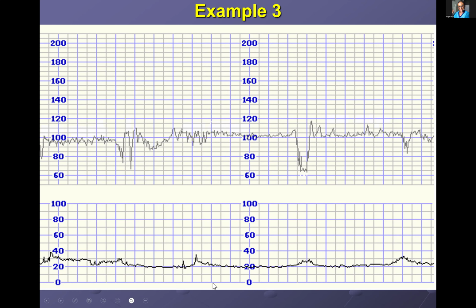Here they give you the impression that they're not strong, but from the CTG you can't really determine the strength. What you can see is that there are about 2. Here perhaps there are 3, but there's a bit of loss of contact there. Here they're a bit more clear. So there are definitely some contractions.